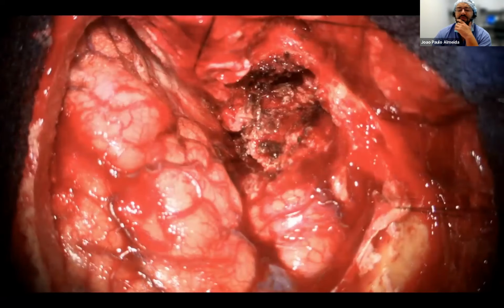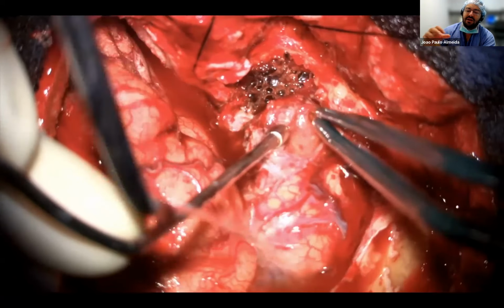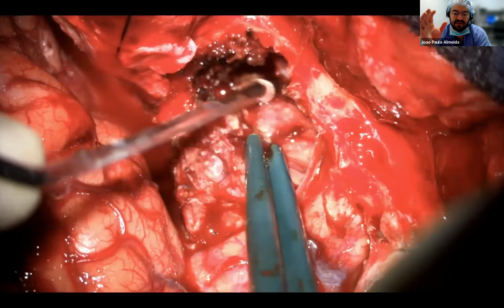Anyways, now what we're gonna be doing is the debulking has been completed. So the core of the tumor has been removed. And now we're gonna peel the capsule away. So we're gonna be mobilizing it away from the temporal lobe. And you see that being performed right there.